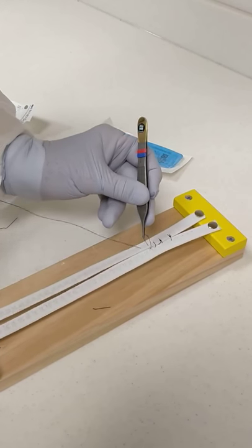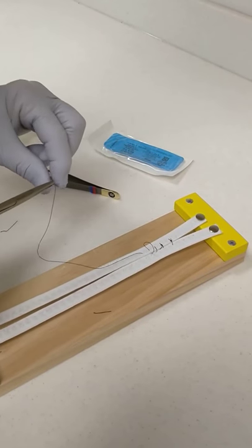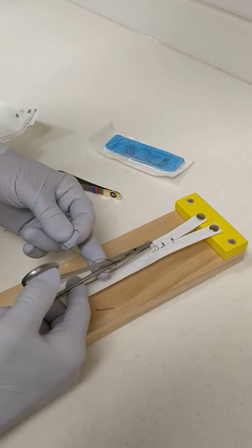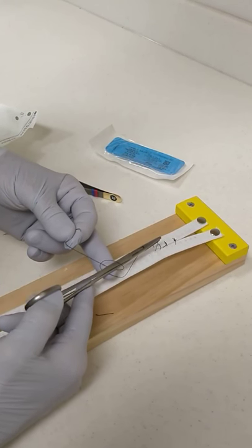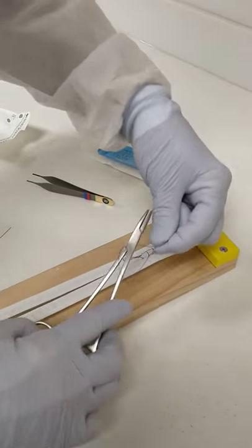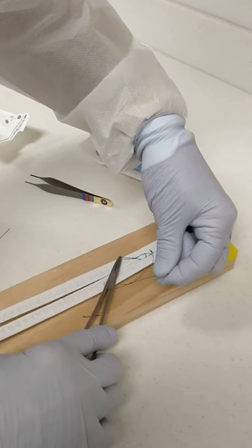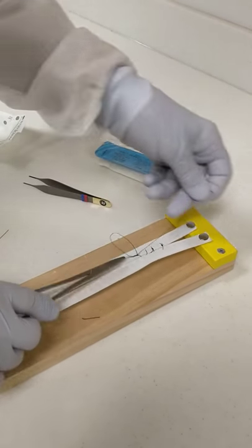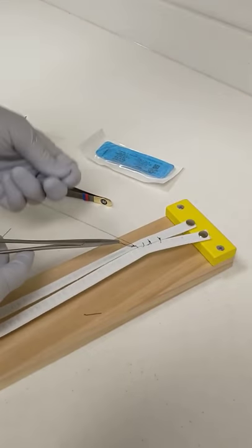Let me get to your final suture. I'm going to wrap it once. Grab the loop in the center, lift up on it, and clamp. Make a square knot. And you're done.